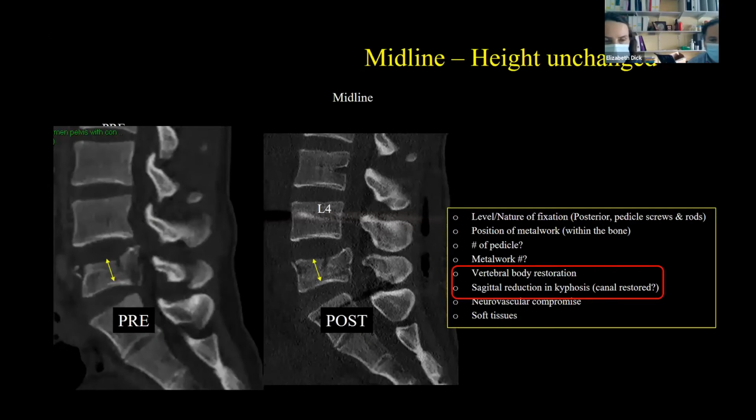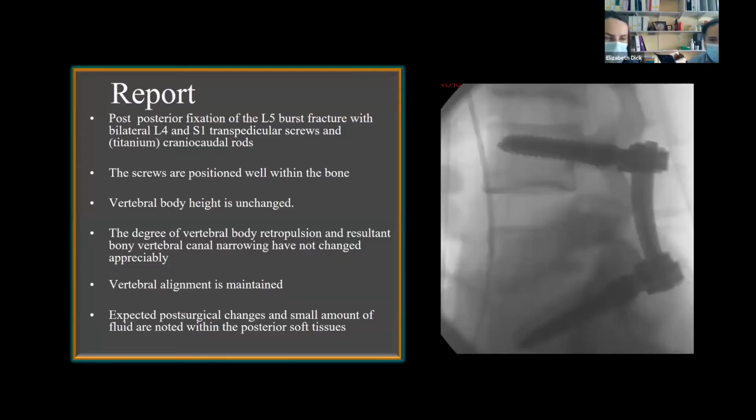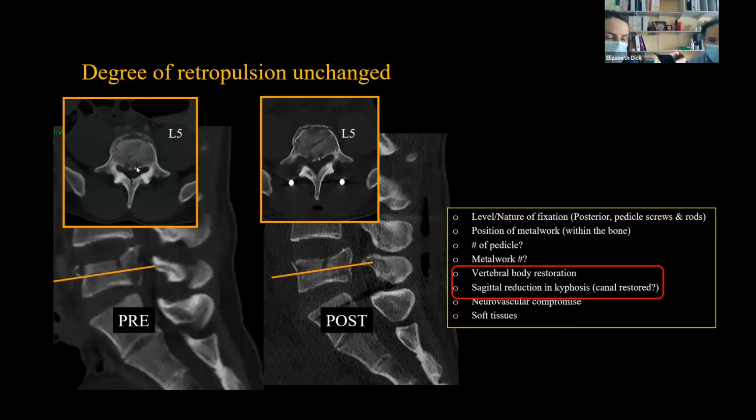But if we look at the height of the vertebral bodies here, I've just put up the pre and the post imaging. You can see there wasn't really much change in vertebral body height for this patient. And if you look on axial imaging at the degree of retropulsion, just here, so this was the degree of retropulsion pre and post, and they're more or less the same.